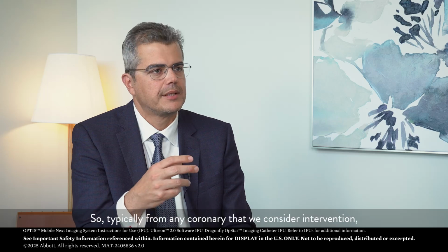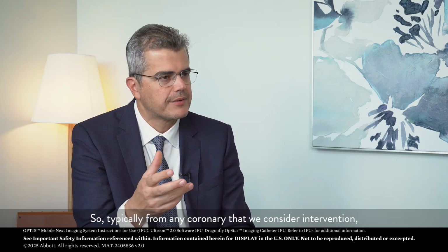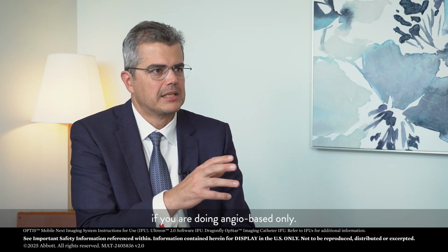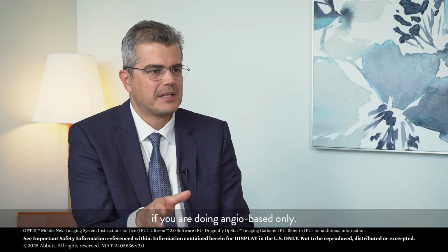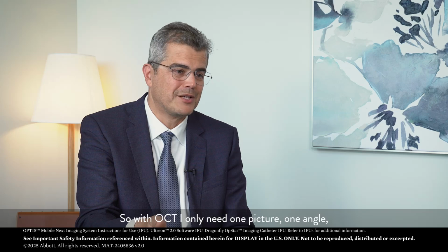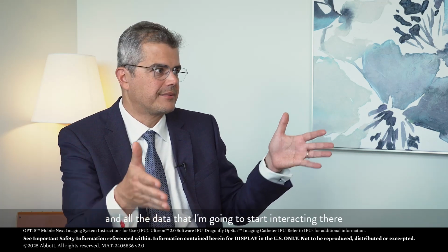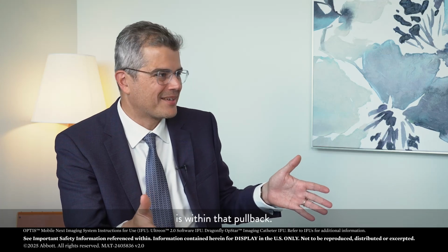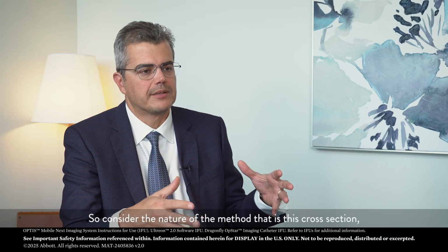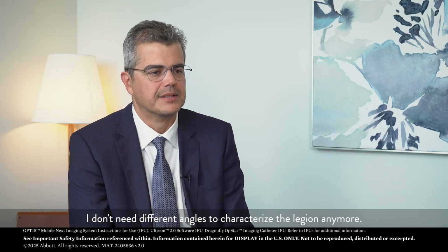So typically, for any coronary that we consider for intervention, we take more than one projection if you are doing angio-based only. This is not true with OCT, right? So with OCT, I only need one picture, one angle, and all the data that we are going to interact with is within that pullback. Consider the nature of the method, that it is cross-sectional. I don't need different angles to characterize the lesion anymore.